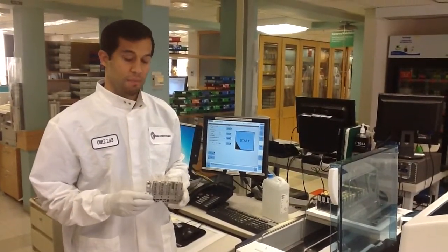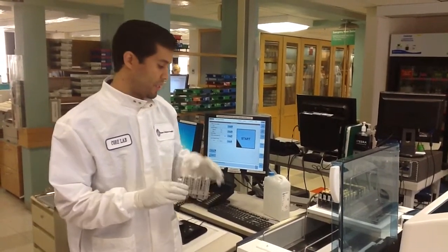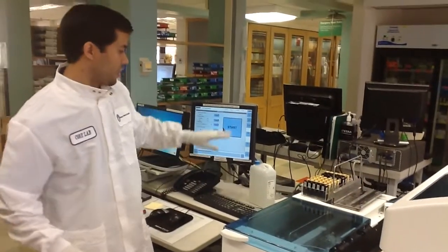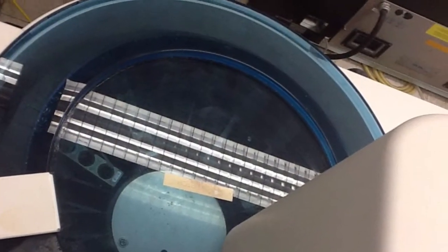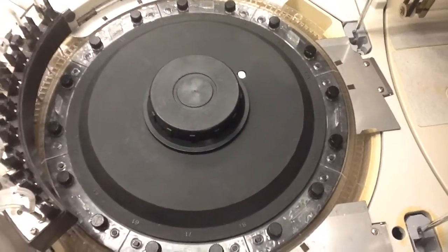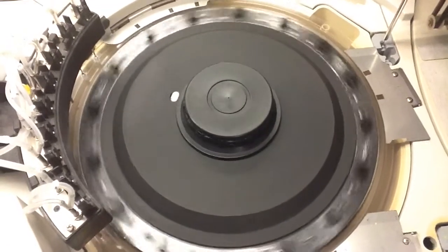The sample rack with correctly and incorrectly labeled tubes is placed onto the instrument and the instrument is started. Once the instrument starts, the barcodes are read, then the samples are aspirated and the tests are run. Approximately 15 minutes later, the results are read.